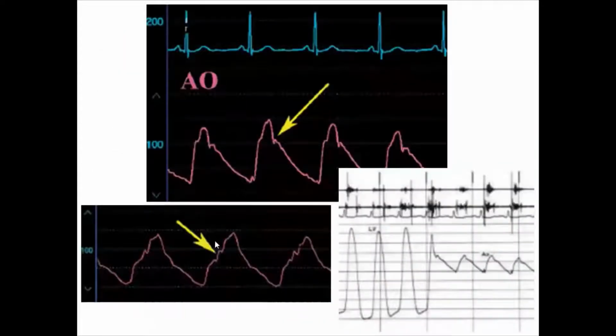Sometimes you can see a notch in the ascending limb, and this is called the anacrotic notch. It can occur with severe aortic regurgitation and premature closure of the aortic valve. It can also be seen in cases of severe aortic stenosis due to turbulence of blood flow during ejection.